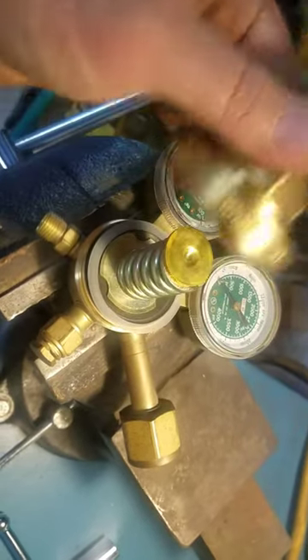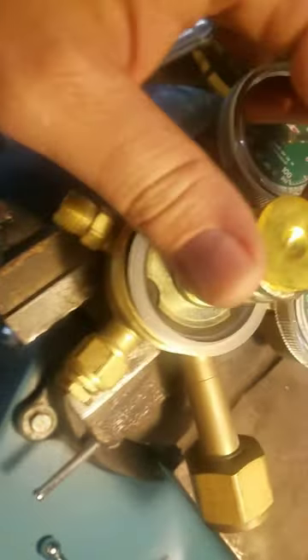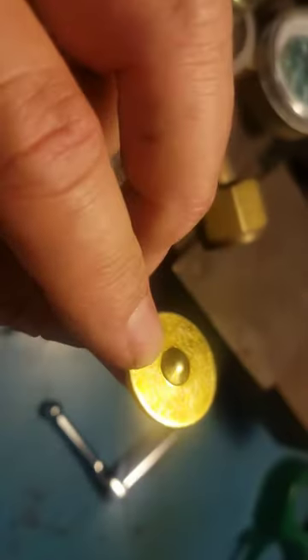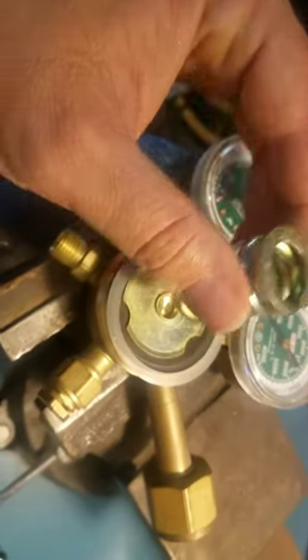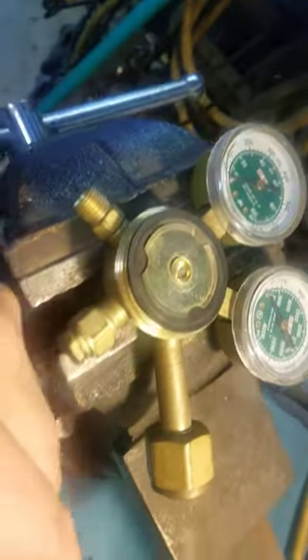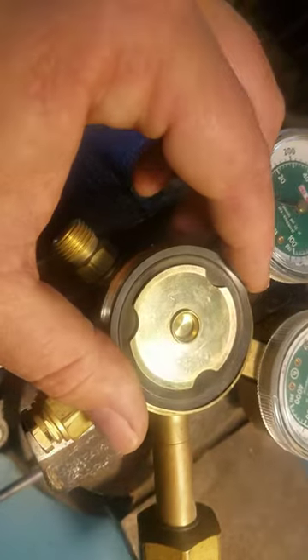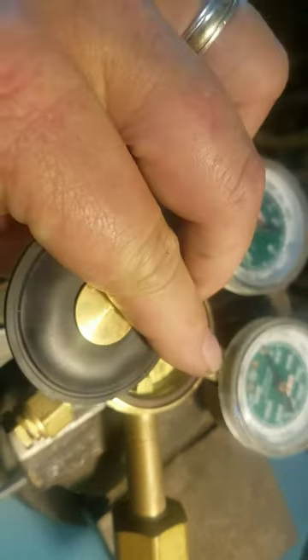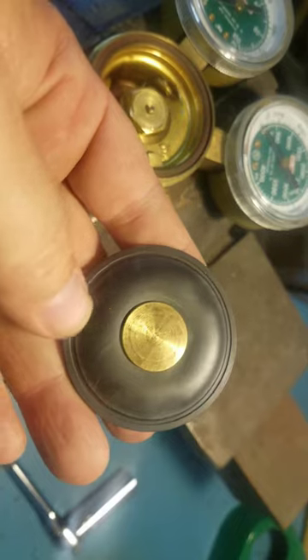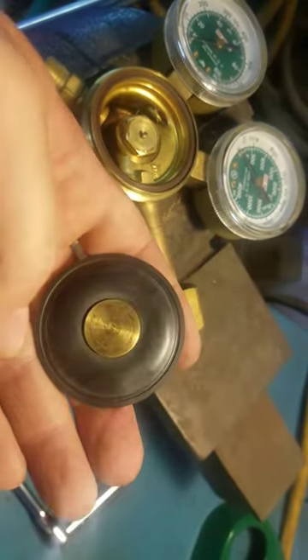Taking off the top of this Victor. That's the rubber diaphragm. Looking at it, it looks okay. Don't see any holes in it.